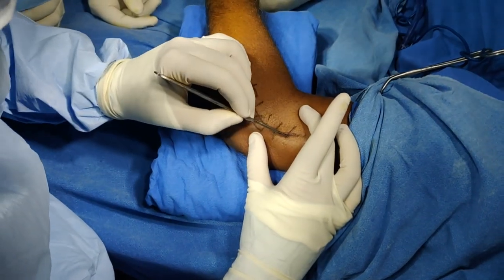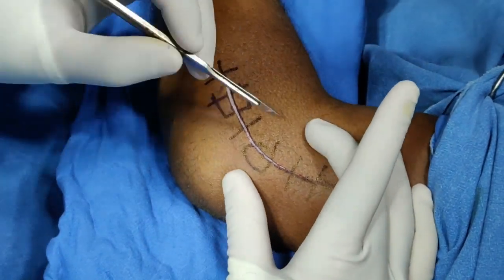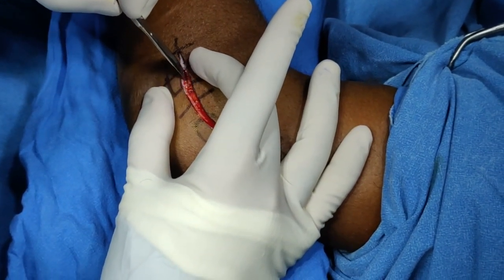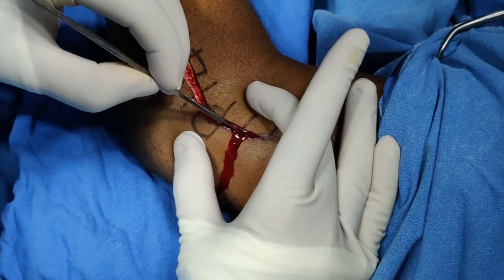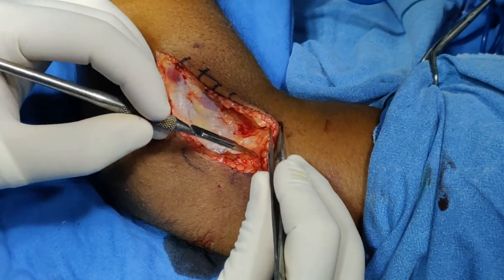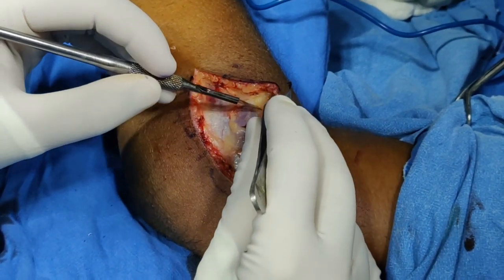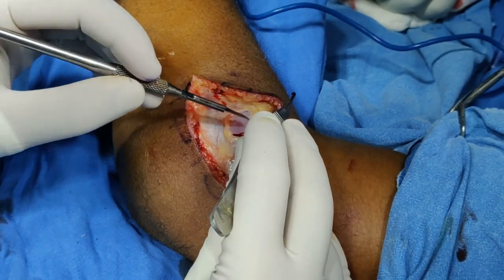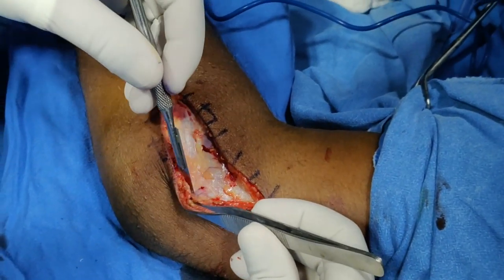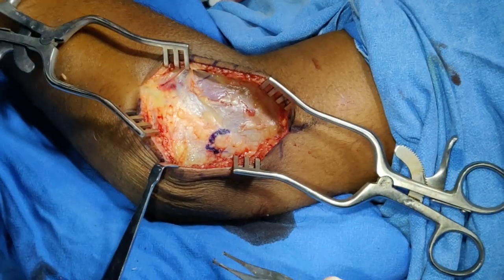We will start with this incision — I will try to take a smaller incision and see if it suffices; if necessary you can always extend it. After the superficial skin incision we do the subcutaneous dissection. We have done our skin and subcutaneous dissection. I am now raising flaps on both sides — never grab the skin, just lift it so you don't cause any unnecessary trauma.